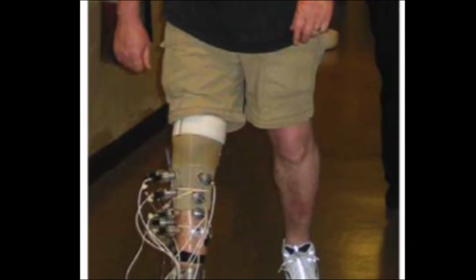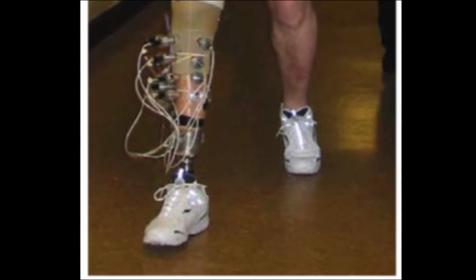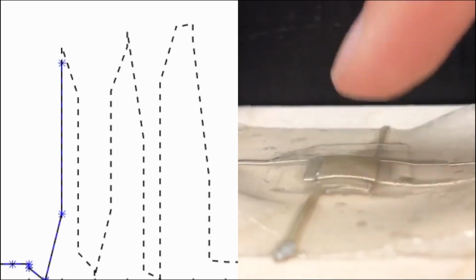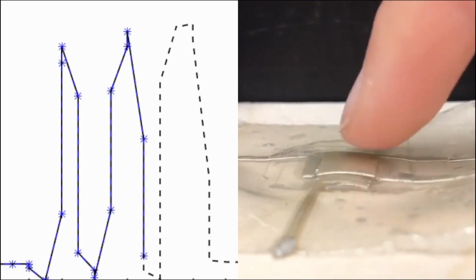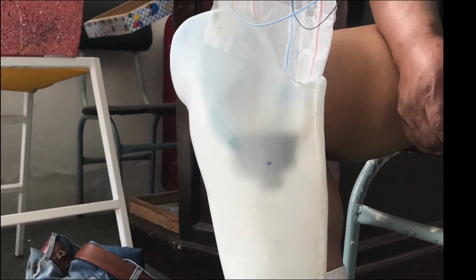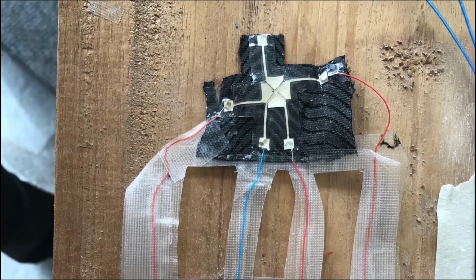For my thesis, I've created soft, flexible sensors that measure pressure and shear. When integrated seamlessly into a prosthetic liner, these sensors will be used to design sockets that reduce painful pressures, hopefully enabling more people to find comfort in walking.